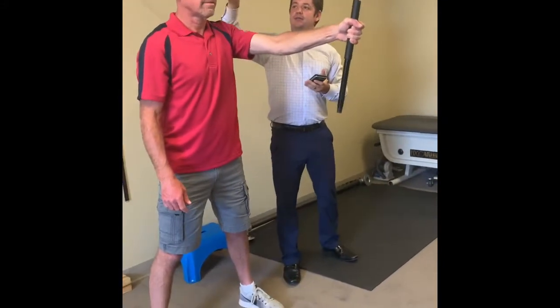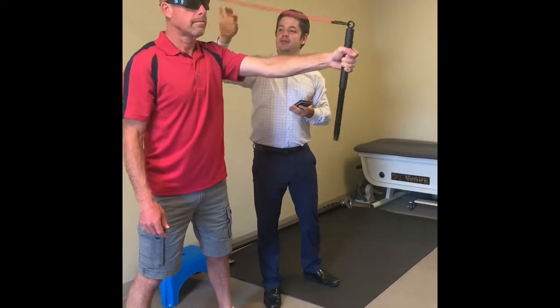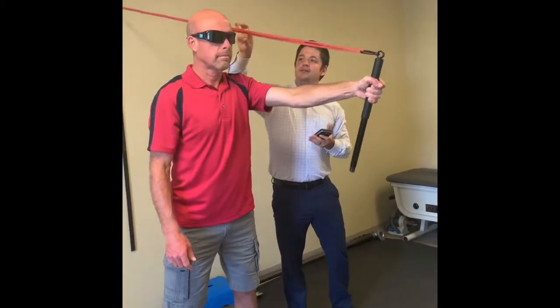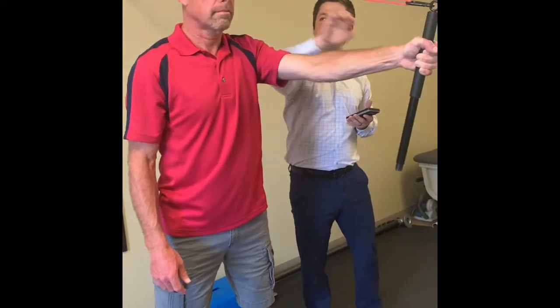So once again, we're working proprioception, or basically stabilization of the shoulder, and trying to get him to have a good lever system up here so it takes some stress off the forearm muscles.